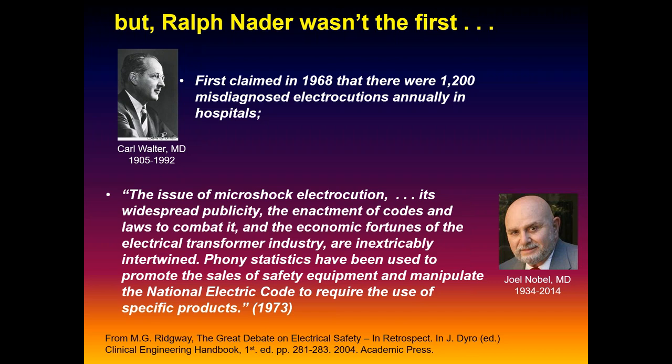So I'm doing it for a couple of months. It takes half a day, because you have the big ohm meter, you're going around the floor taking ohm readings, and you have to take averages. After a couple of months, I thought, what am I doing? Stupid test. So I just quit doing it. And I had other things to do.